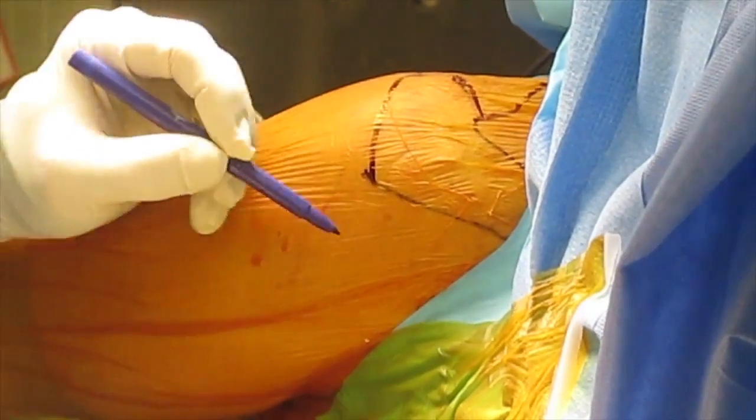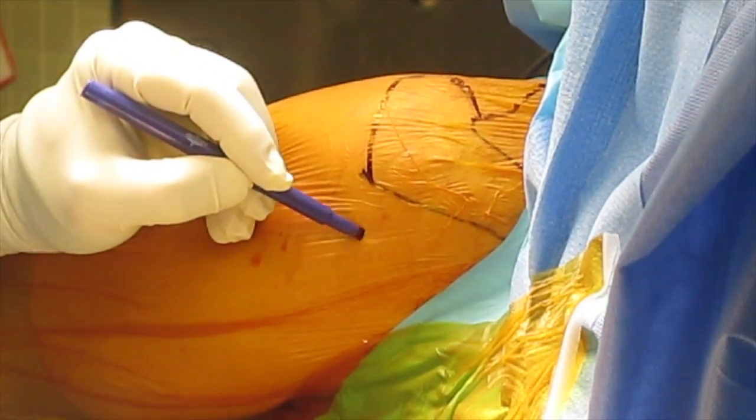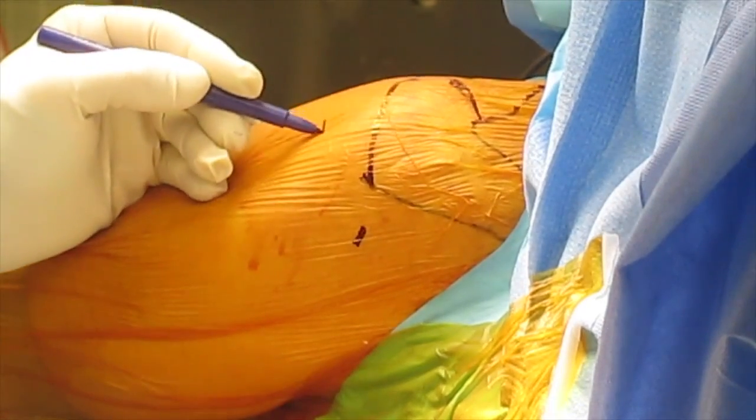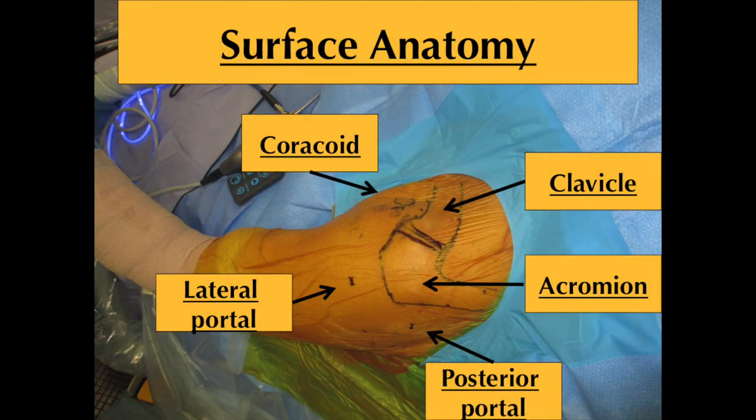First, position the patient in the beach chair position, taking care that the head is well padded and that the cervical spine is in neutral alignment. Ensure that the operative shoulder is accessible circumferentially. Perform a routine prep and drape.